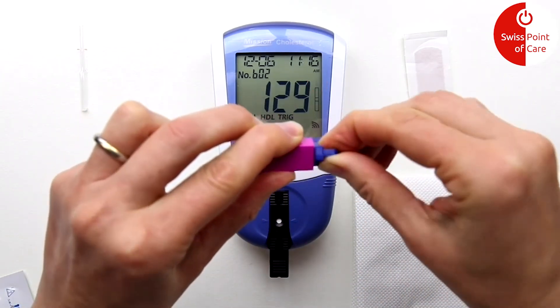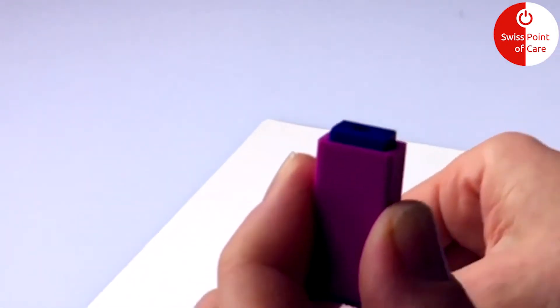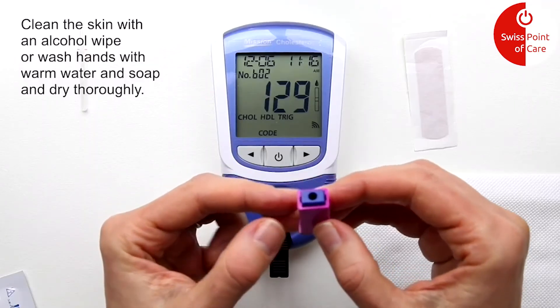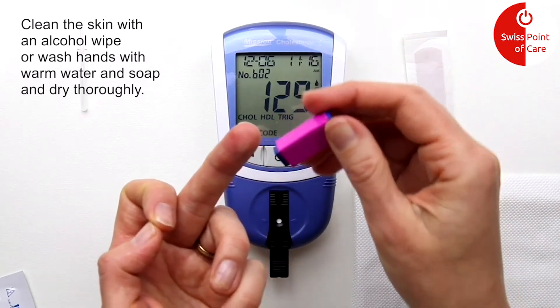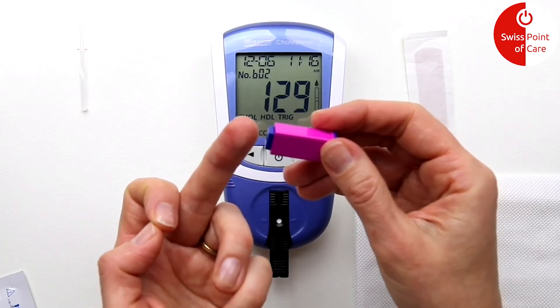You can now start drawing blood with the lancet. The protective cap of the lancet can be gently rotated and removed. After cleaning the skin, you can hold the lancet on the puncture site. Press the lancet firmly against the puncture site and press until you hear a click.